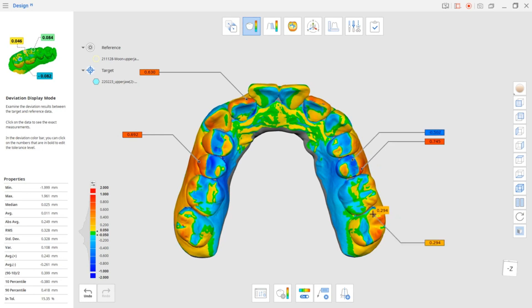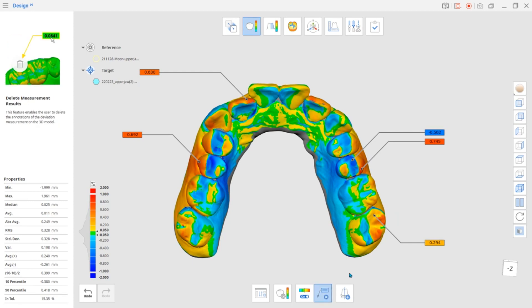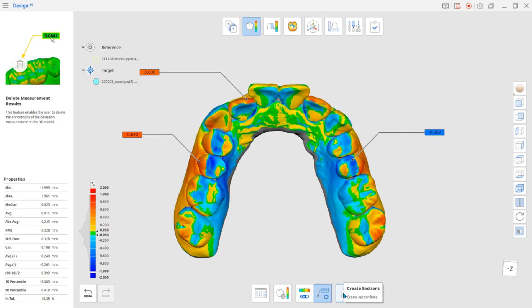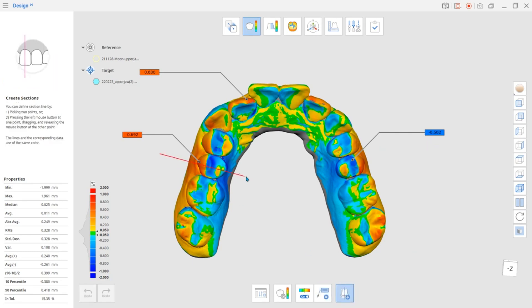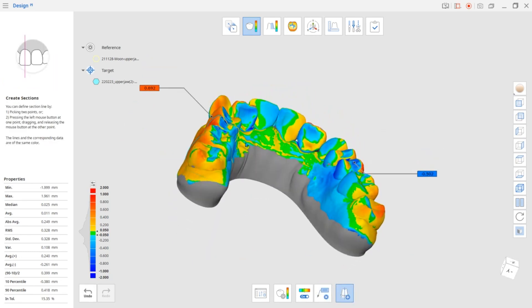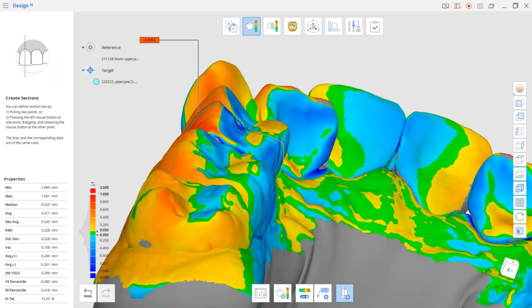To delete the results, select Delete Measurement Results at the bottom and click on the annotation. Use the Create Sections tool to draw the lines and check selected section and details.